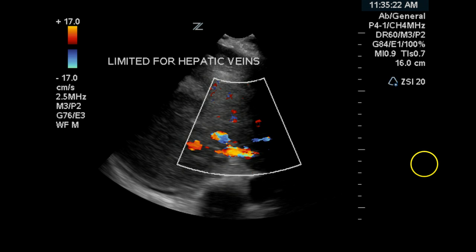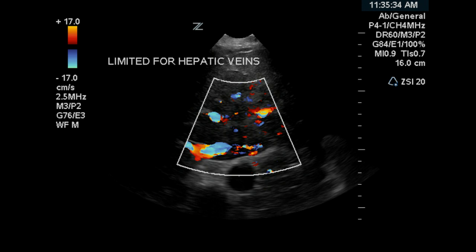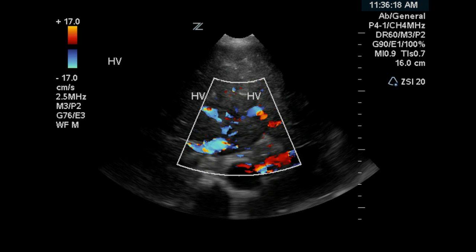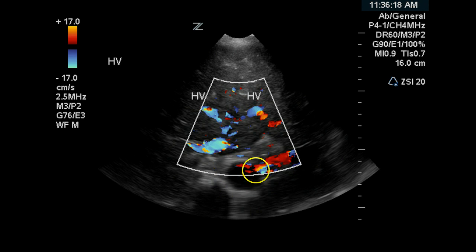There are limited views of the hepatic veins, but all three of them appear to be filled with color indicating that they are patent. Another image shows the patency of the hepatic veins, and one more shows the right, middle, and left hepatic veins all flowing in the correct direction toward the vena cava.